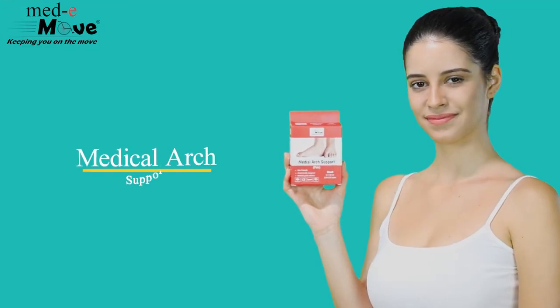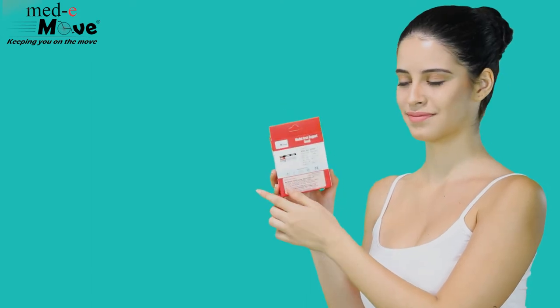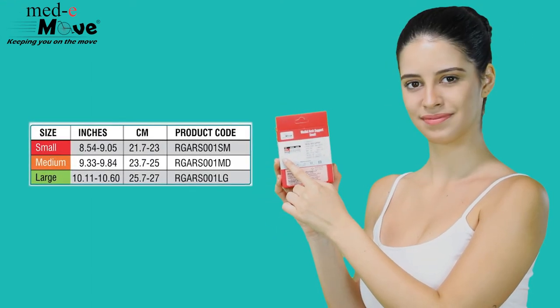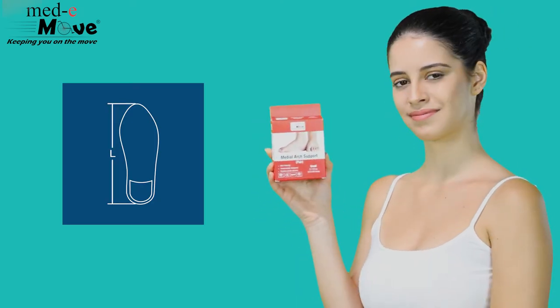Here we will demonstrate how to measure the size and wear the Medimove medial arch. The medial arch support is available in three sizes. Measure the size of your feet and then refer to the chart printed on the box.